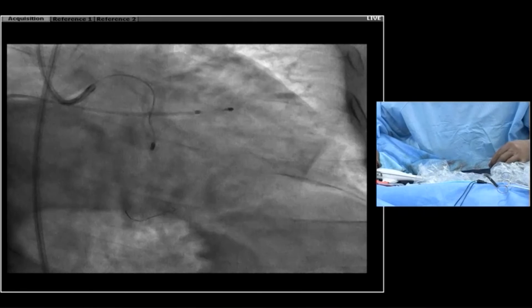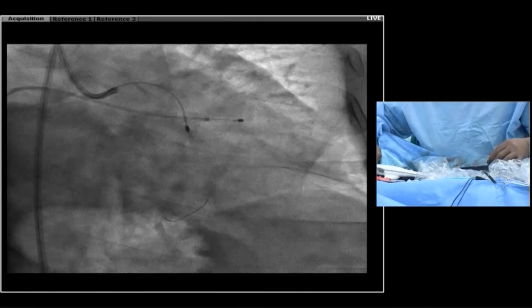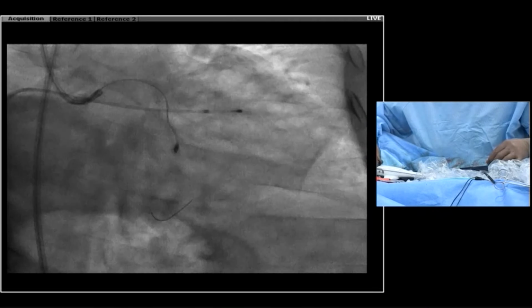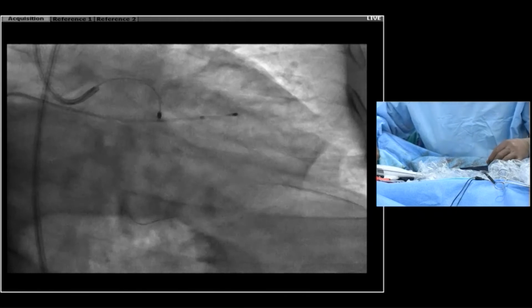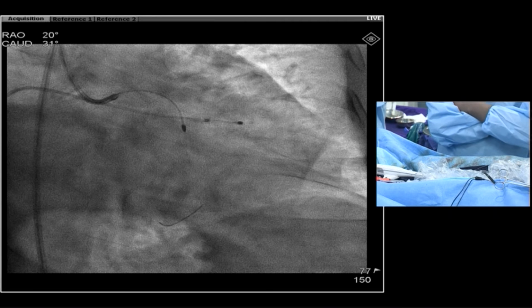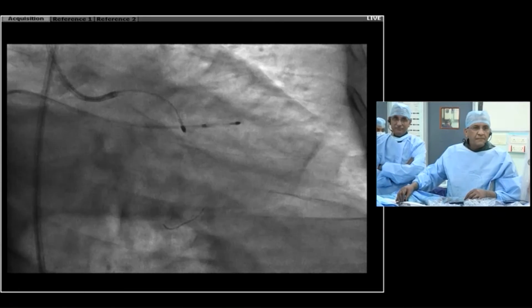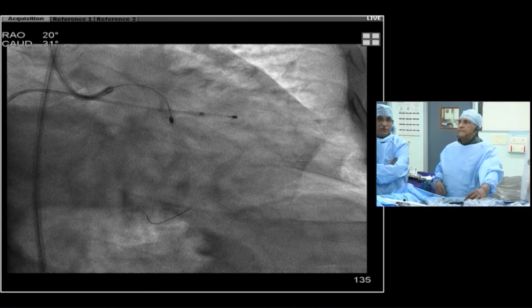I think a very important point is to use the pecking technique, not to push too much, because if you push too much, you could have the burr stuck, and then there are many curves between, so you could have really huge troubles removing the burr. And I would go even in this situation with 200,000 speed. So we may have to do that. Go to 200,000 maximum. But this tortuosity is significant, and I think that's the issue that was being experienced.